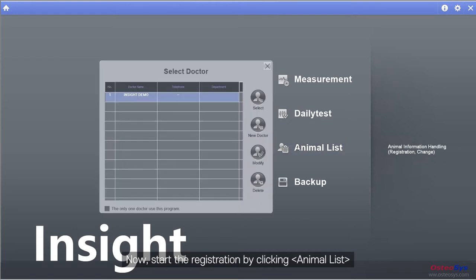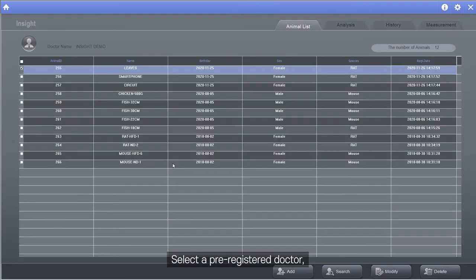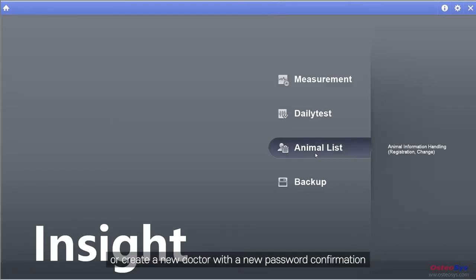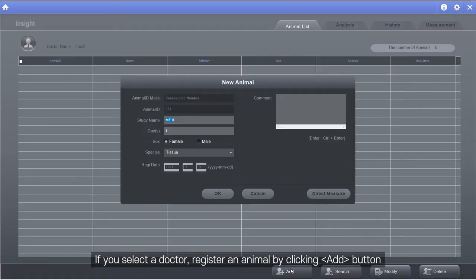Now, start the registration by clicking Animal List. Select a pre-registered doctor or create a new doctor with a new password confirmation. If you select a doctor, register an animal by clicking Add button, write down study name, and select sex and species.